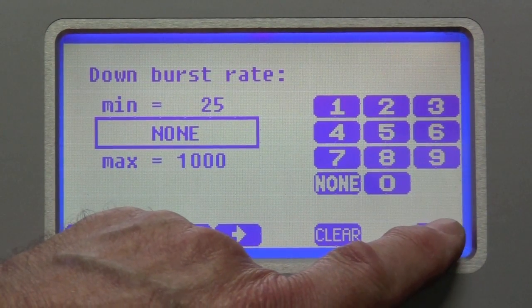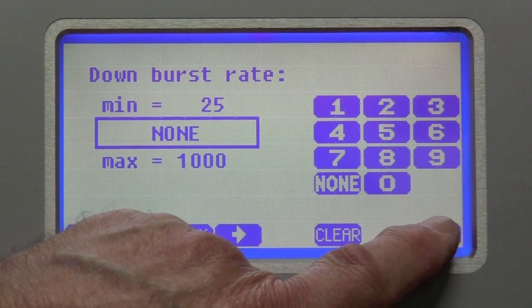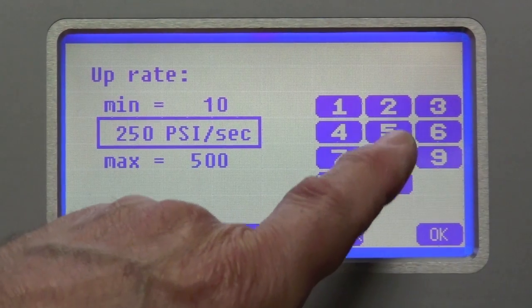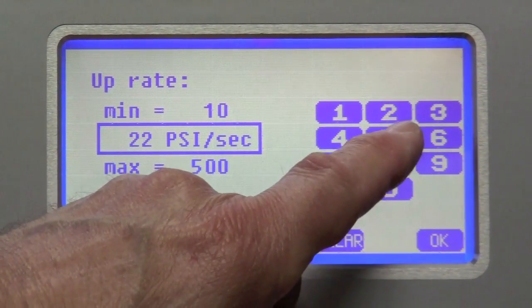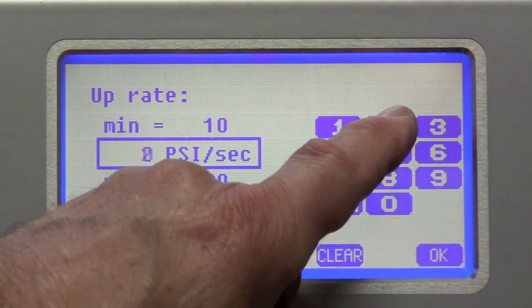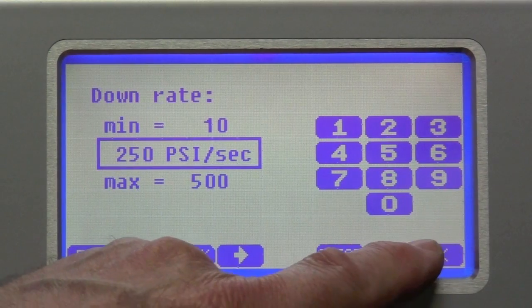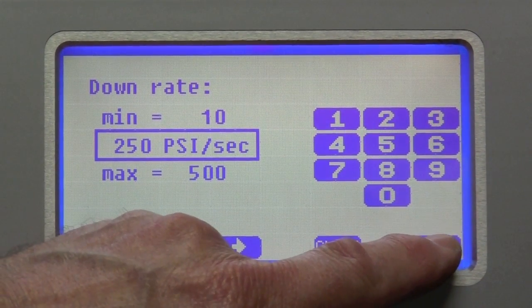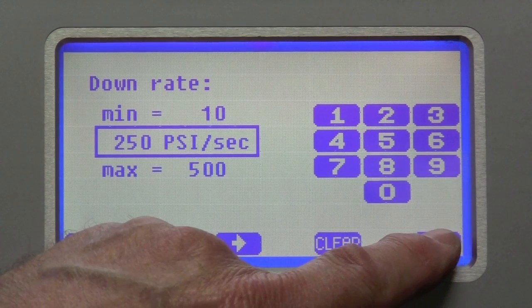The downburst rate, we don't care about that. We will burst on the way up. And the up rate. And I'm going to make it 25, 25 psi per second. And the down rate doesn't matter because it will have burst by then. So I'm going to leave it at default of 250.